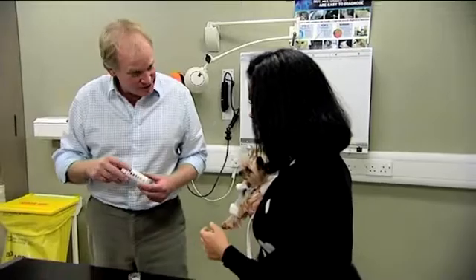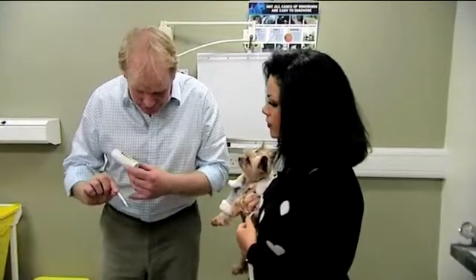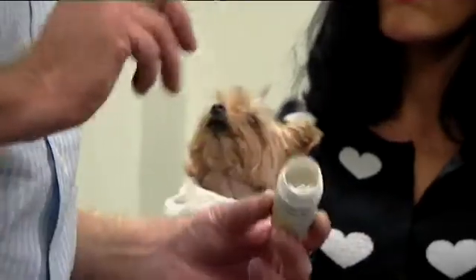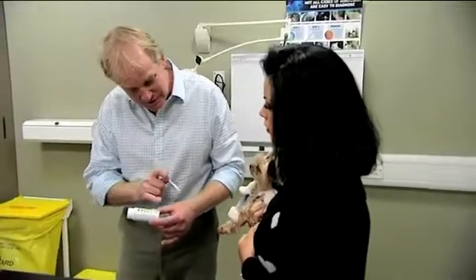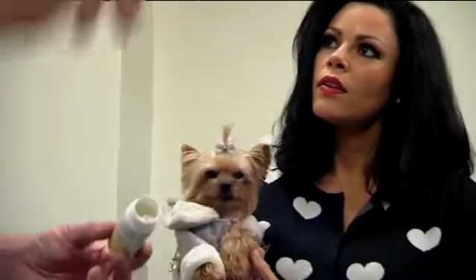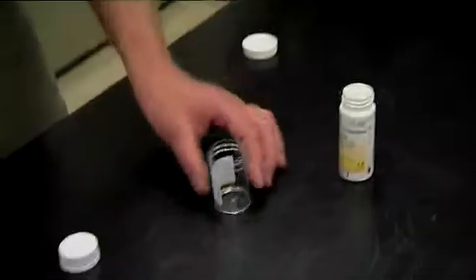What we're going to do is test this urine using a little dipstick that looks for the glucose in the urine. The dipstick here you can see is blue, and if there is no glucose it stays blue, but the more glucose there is, the browner it becomes. It's a really simple test that people can do at home to check that the urine is clear from any sugars.